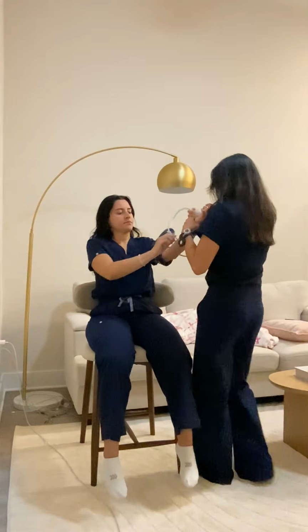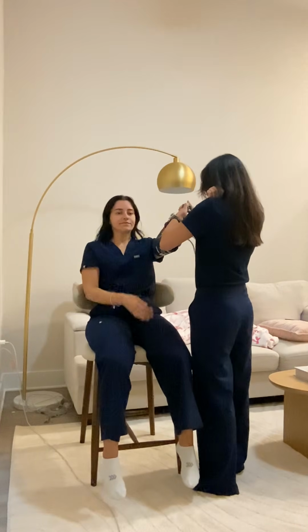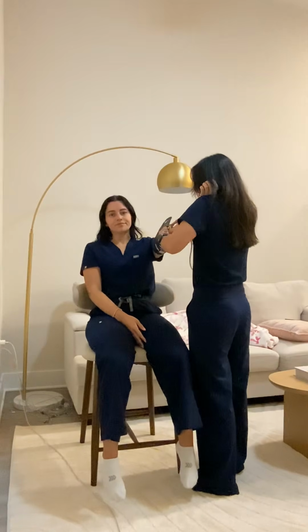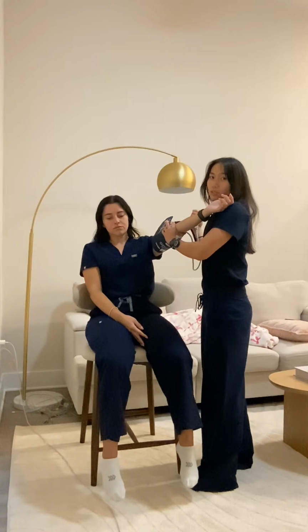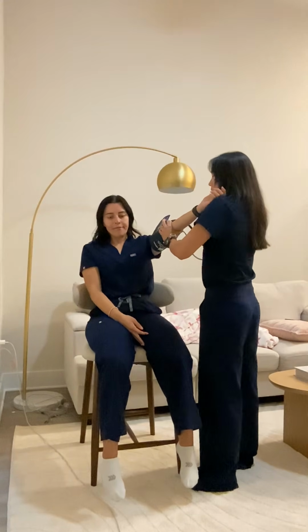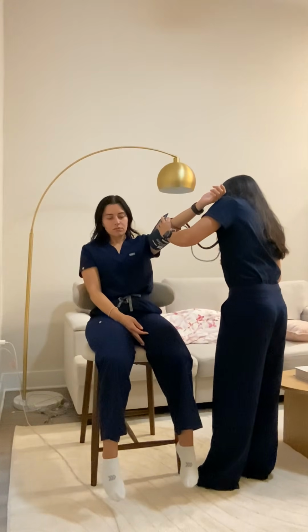I will raise up the arm. Now, what I'm doing is I am listening for the onset of the first Korotkoff sound, which will indicate the systolic blood pressure. And then I am going to slowly release the dial 2 to 3 millimeters mercury per second, and the cessation of that Korotkoff sound would be the diastolic blood pressure. All right, I'm going to pump it up 30 millimeters mercury above that palpable systolic pressure.